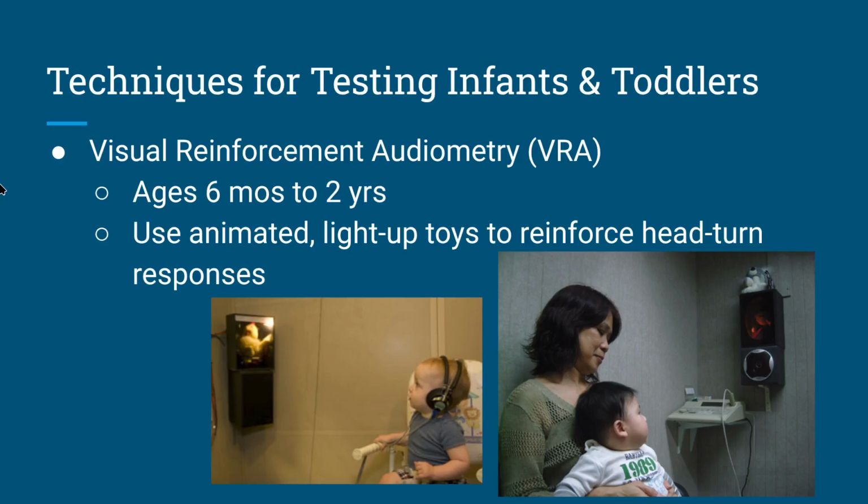Use the same frequency and test modifications that you use in conditioned play audiometry. Those can also be used in visual reinforcement audiometry. That's all I've got for this lecture here.